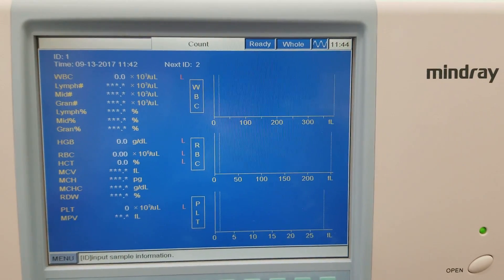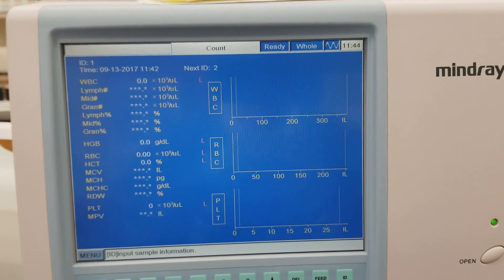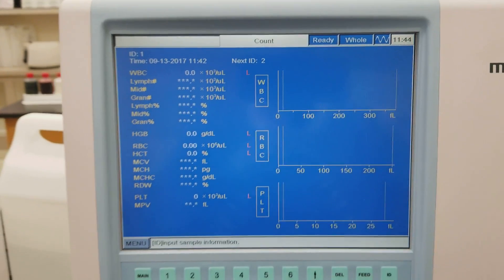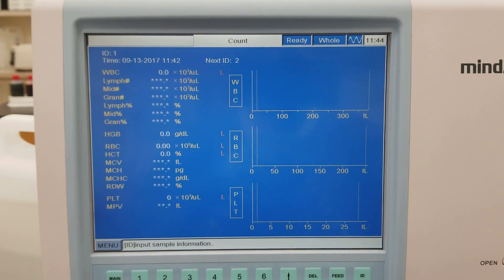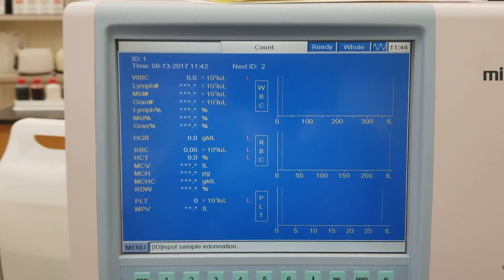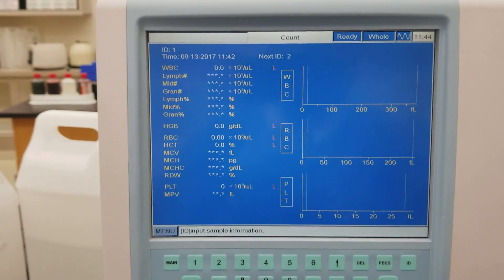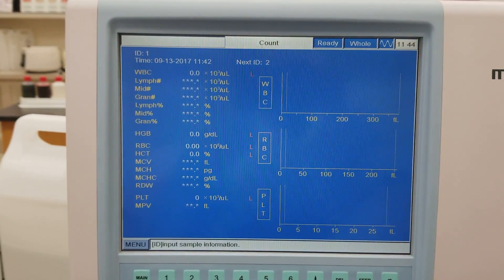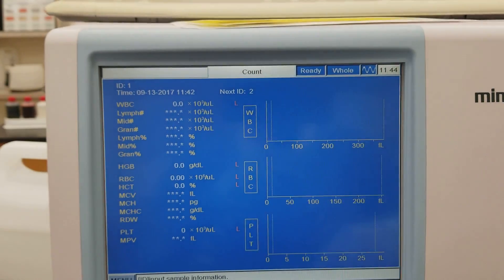In a previous video, you saw me clear flags from the screen and replace a couple of reagents to make sure the flags didn't come back and that we had everything good. I ran alcohol as a patient to get rid of the last abnormal background and hemoglobin errors.